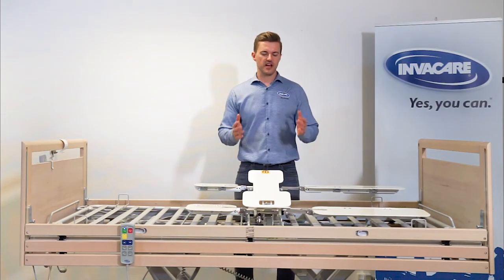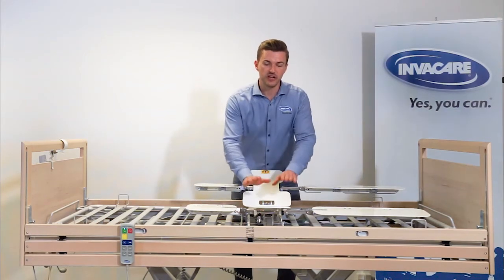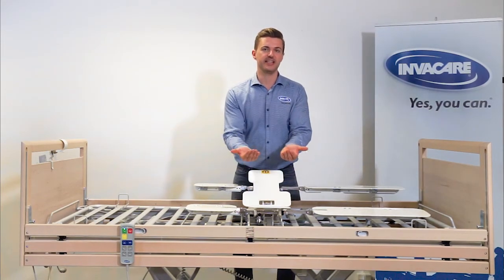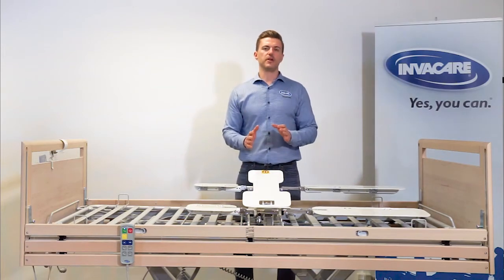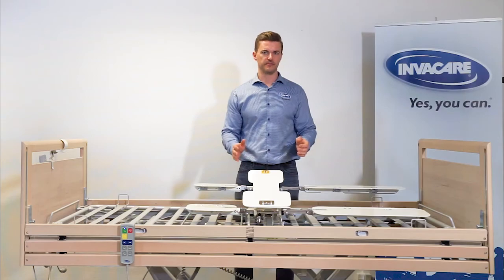Depending on the settings, the side that the patient is lying on after being repositioned will either go flat or stay slightly elevated. We always recommend a slightly elevated side to give maximum support for the patient.